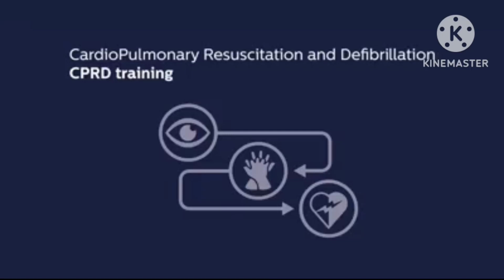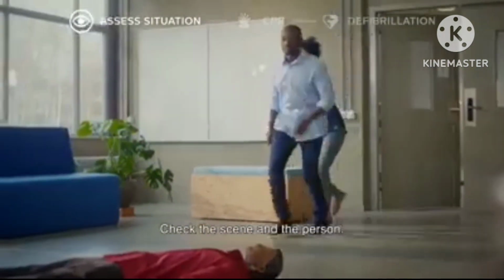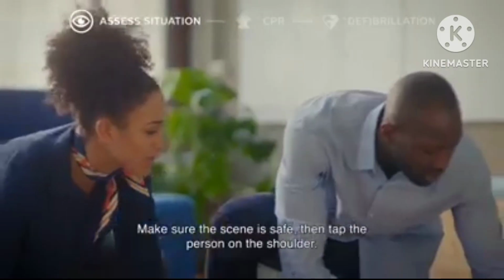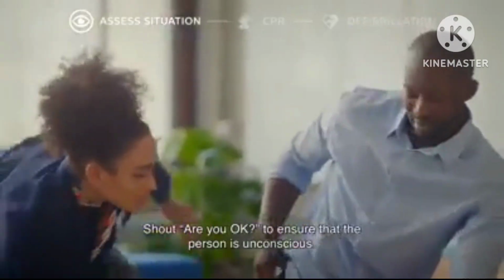Cardiopulmonary resuscitation and defibrillation, CPRD training. Check the surroundings. Check the scene and the person. Make sure the scene is safe, then tap the person on the shoulder. Shout, "Are you okay?" to ensure that the person is unconscious.